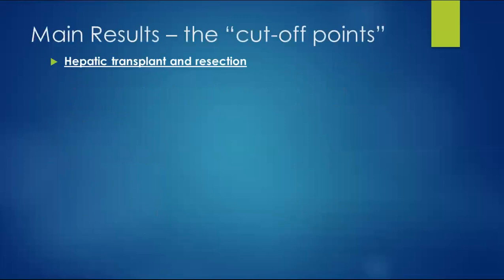This slide essentially summarizes the main findings from all of the results. It can probably be summarized by the number approximately 10 mils per kilo per minute, which is their main cutoff point, which predicts if you're able to reach that point, then you generally have a 90-day plus survival probability. If you're getting less than that in the anaerobic threshold department, then you're potentially unfit for this type of intra-abdominal major surgery.